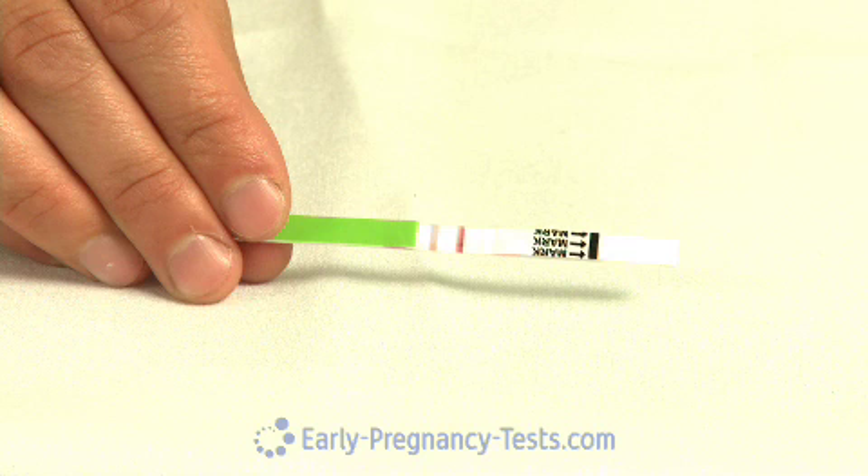After 10 minutes, interpret the results. Note that we've compressed the 10-minute time period into just a few seconds for the purposes of the video. With an ovulation test, unlike a pregnancy test, you compare the intensity of the test line to the intensity of the control line. If the test line is as dark or darker than the control line, that indicates a positive result, and you will probably ovulate within the next 24 to 48 hours. If the test line is less dark than the control line, or if it can't be seen at all, that indicates a negative result.